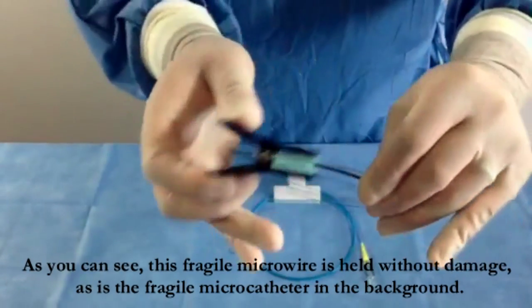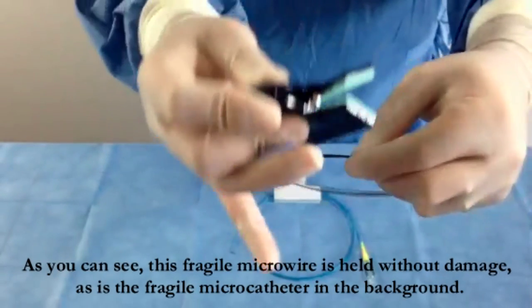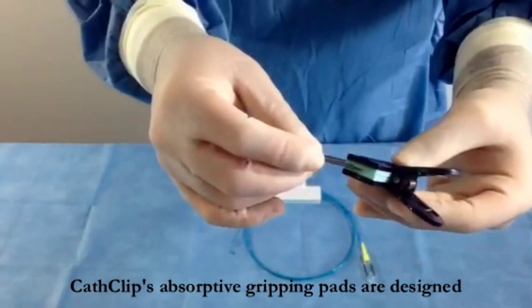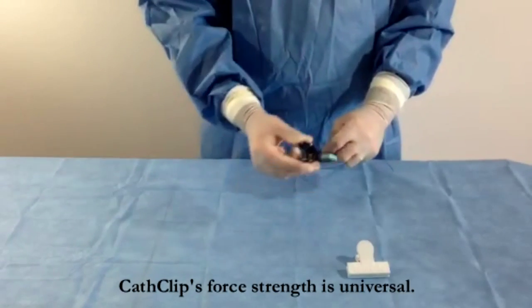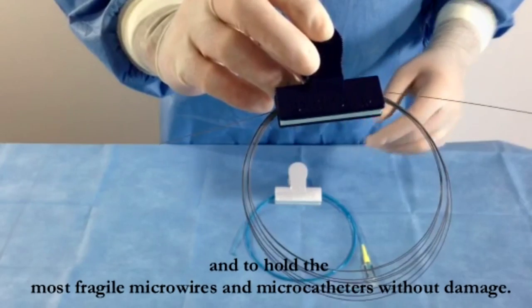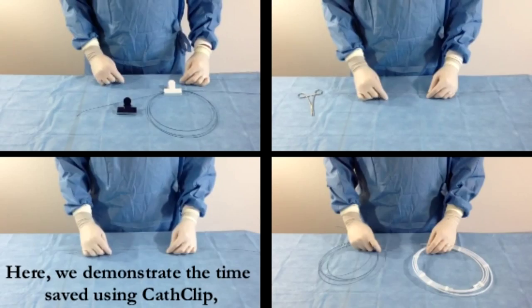As you can see, this fragile micro wire is held without damage, as is the fragile micro catheter in the background. CathClip's absorptive gripping pads are designed to remain moist throughout the procedure when dipped into saline solution before use. CathClip's force strength is universal — it has been chosen to hold the stiffest wires securely and to hold the most fragile micro wires and micro catheters without damage.